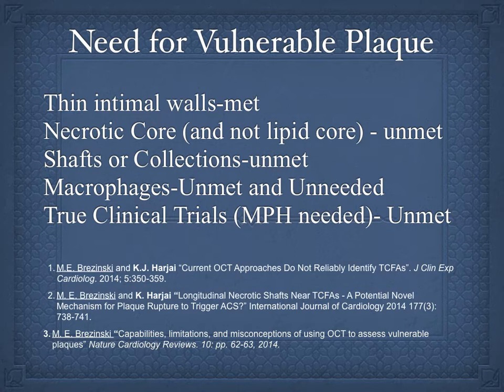I mean, we believe just qualitatively looking at the image is a more effective approach, something that as a clinician you're used to doing, but people who work with numbers, who want a quantitative approach like diffuse borders or specifically exponential decay, often don't appreciate that.